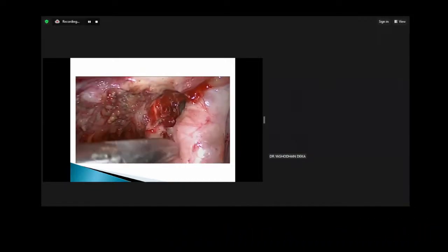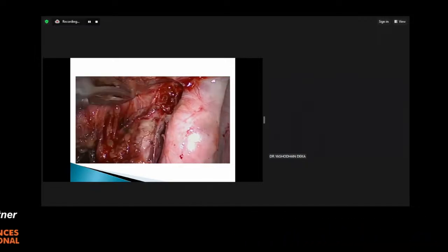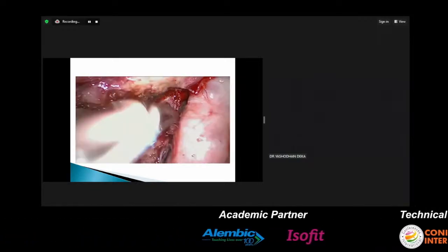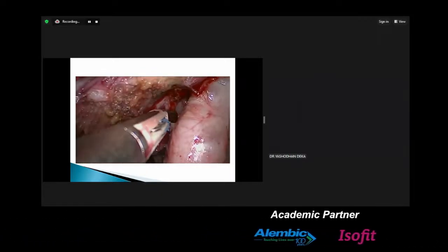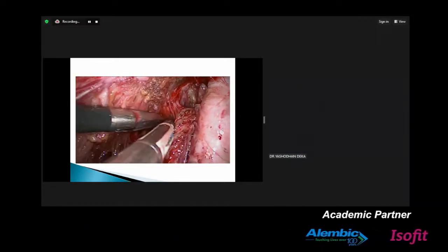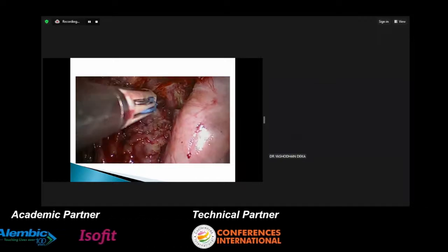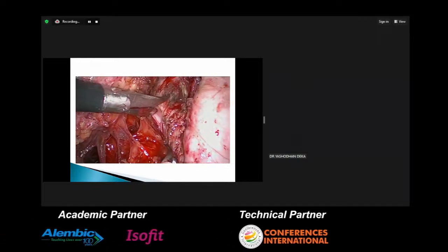We used to use vasopressin in these areas before, but now we have realized that vasopressin actually gets you lost in the tissue planes. So it is better that you just continue with your regular dissection, see the rectovaginal space, you're right open, because in such spaces bleeding actually helps you guide where you have gone. If it is bleeding, that means you've gone in the wrong plane, because a nodule does not bleed. So if you're bleeding, that means either you're going into the vagina or you're going into the rectum. So that guides you that maybe you're just millimeters or inches, plus and minus, off, and it really helps you. So we have stopped using vasopressin at any step for endometriotic surgeries.